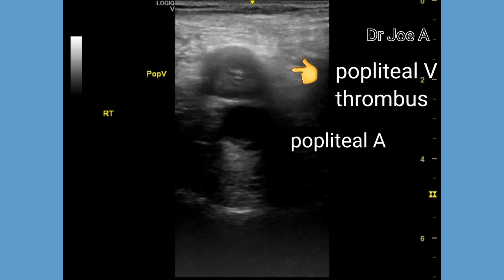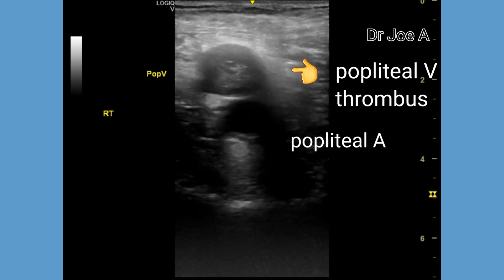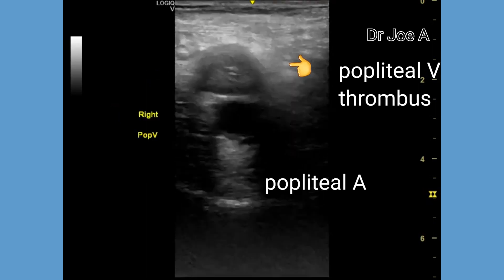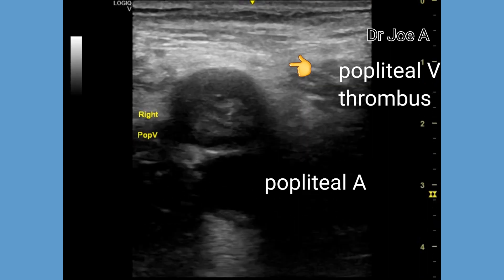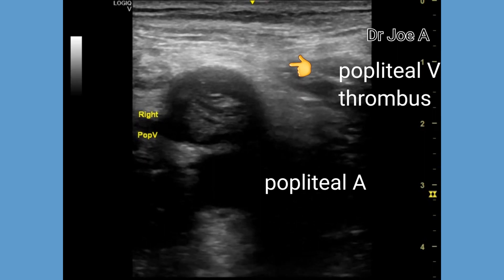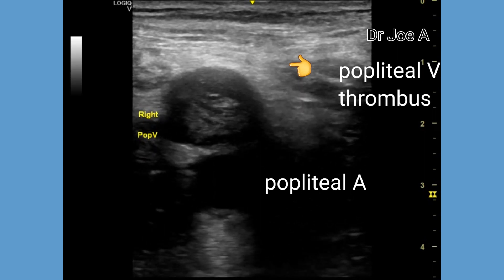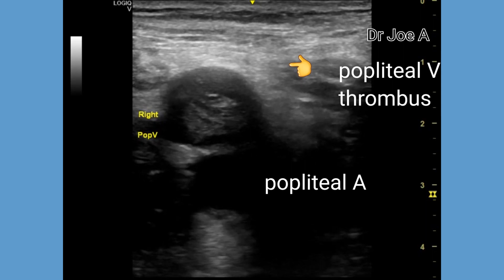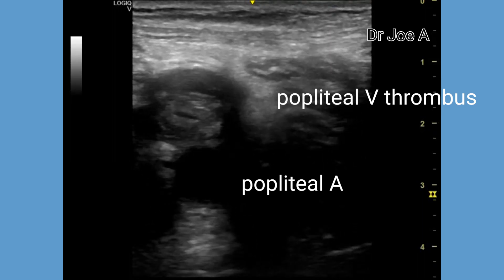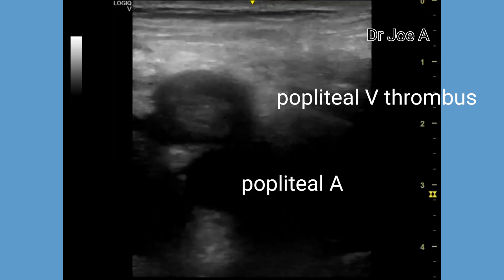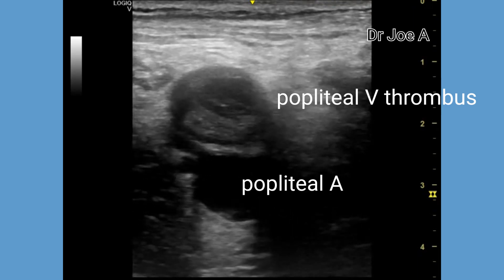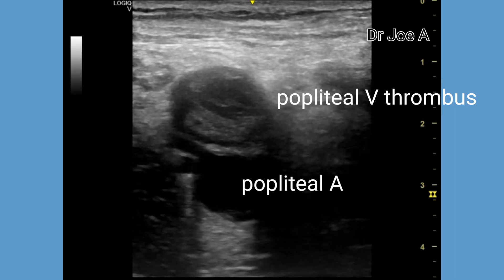As we go down to the right popliteal vein, there too we find an echogenic thrombus within the popliteal vein. The popliteal vein is seen superficial to the popliteal artery. Here too we can see a near total obstruction of the popliteal vein by the large thrombus. The diameter of the popliteal vein is significantly increased compared to that of the popliteal artery, suggesting an acute or subacute thrombosis.